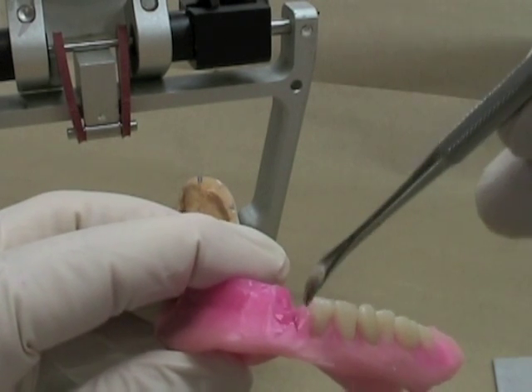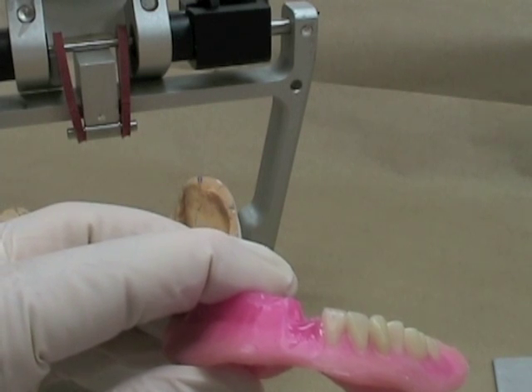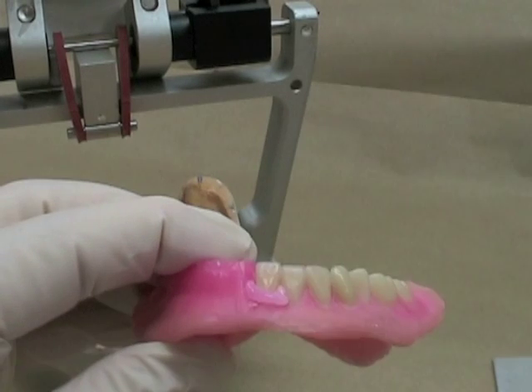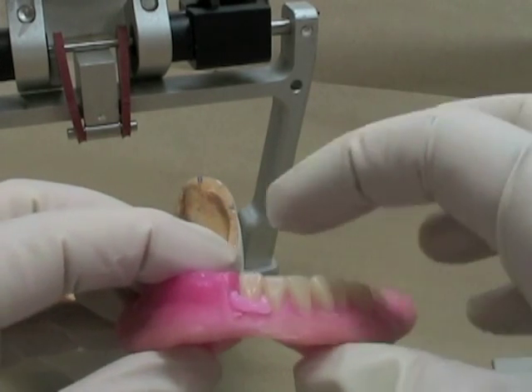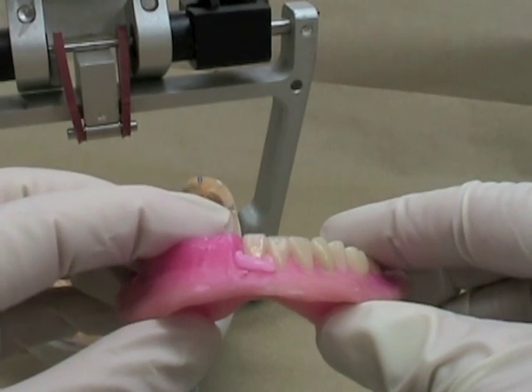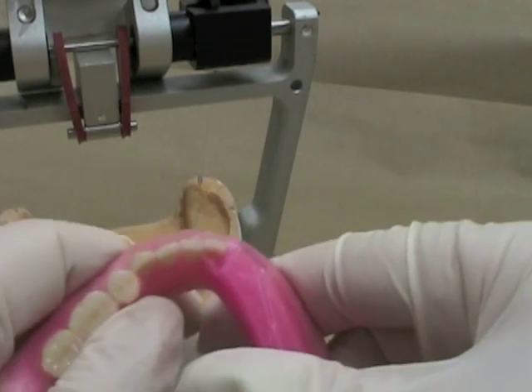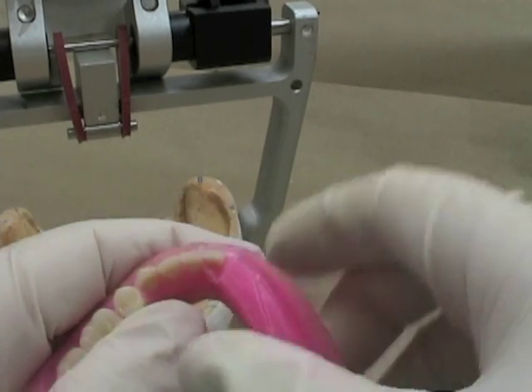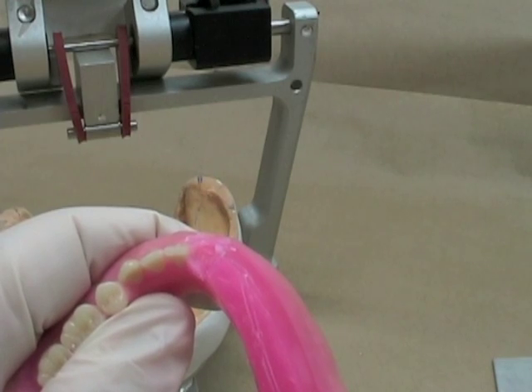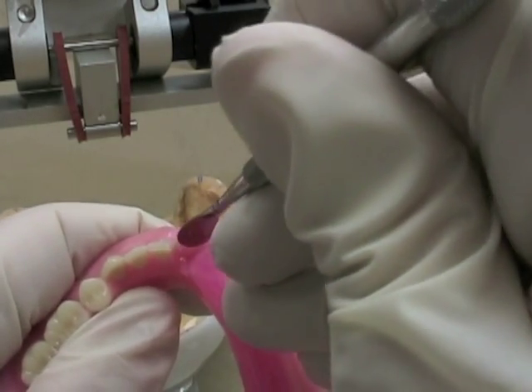My wax is not quite soft enough close to the other central incisor, so I'm going to soften that wax there. Taking a look from the front, you can see it's a little bit higher than the adjacent lateral incisor, and looking from above the neck of the tooth looks like it's out a little bit more buccal. I need to set that in a little bit tighter. I've still got a little bit of wax left, so I'm going to soften it underneath where the neck of the tooth is and see if I can move that without any grinding.